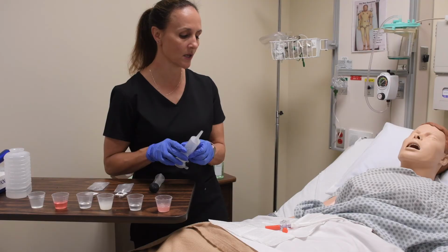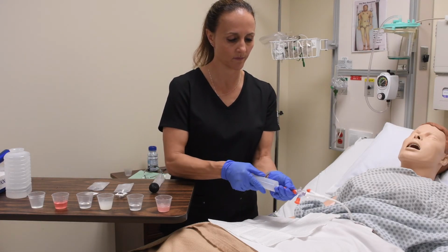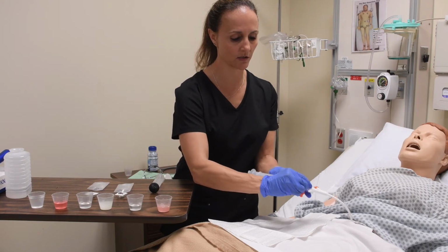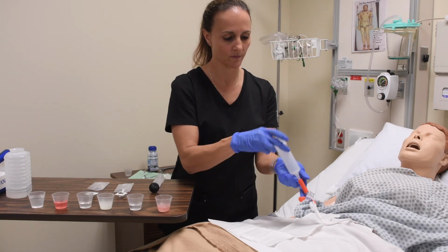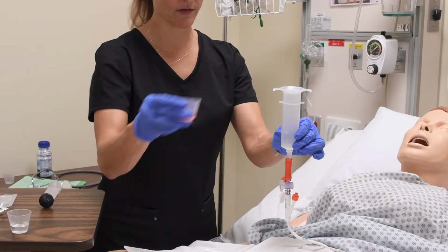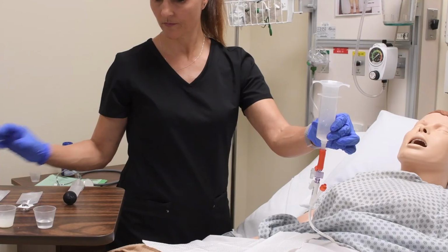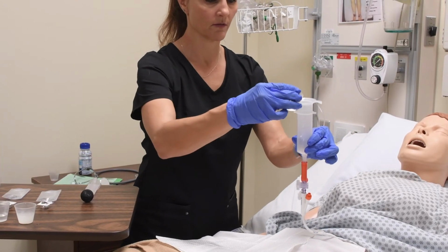Okay, Mrs. Jones, I'm going to go ahead and give you your medications. I'm going to attach and turn it to the on position. And again, I'm going to let it go by gravity. Give my medication. Flush.